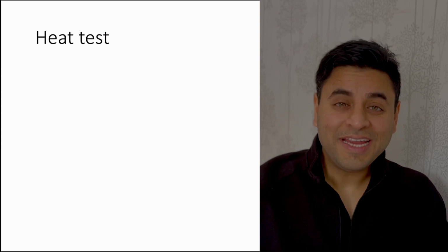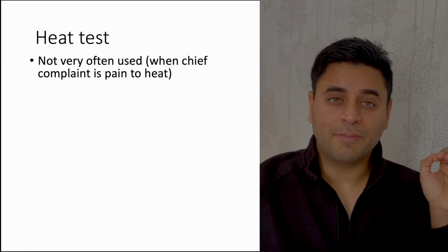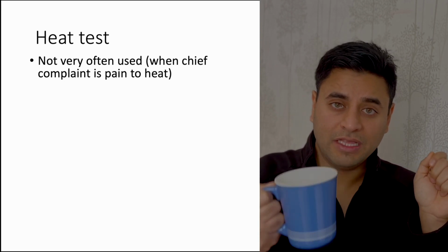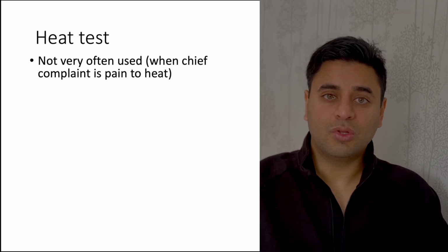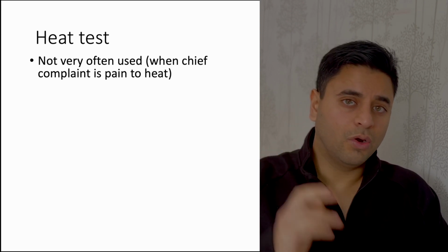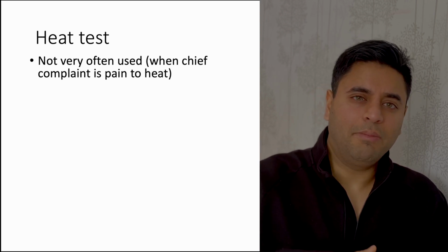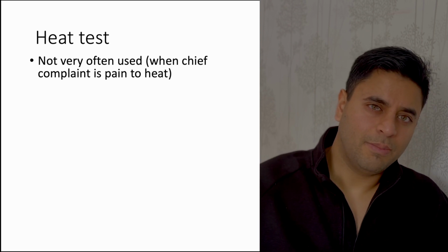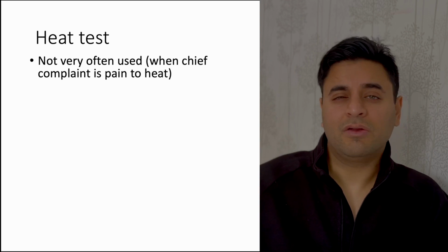All right, let's talk about the heat test now. It's not very often used, because it is only used when the patient has a chief complaint of pain with hot coffee or any hot drink. Other than that, if the patient does not complain of heat, then we do not give a heat test. There is some research which shows that inducing heat to an inflamed pulp may actually damage the pulp further, so we might do more harm to the patient than benefit. That's why we only do a heat test when the patient has a symptom of pain due to heat, which comes from their history, of course.